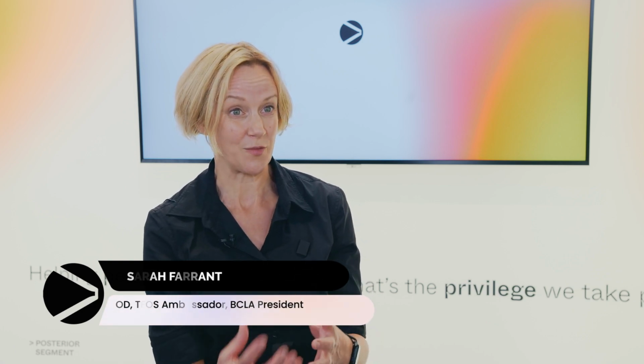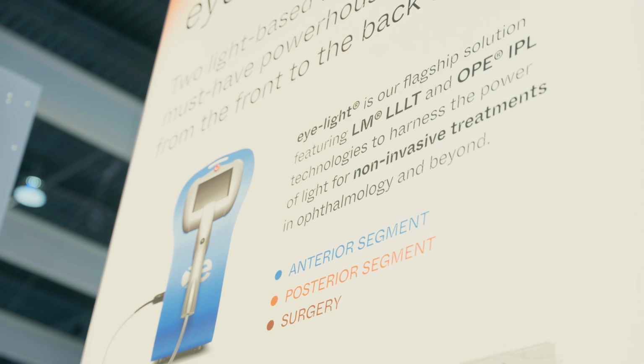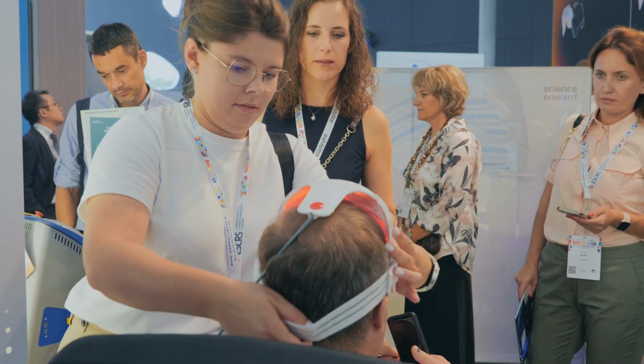Shortwave blue low-level light therapy has a unique set of strategies in which it works. So when we consider the role of dry eye disease and the clinical importance of the dysbiosis of the ocular microbiome, we can start to think about utilizing shortwave blue therapy to help control that dysbiosis. When we have lost that homeostatic balance because of dry eye disease or because of anterior segment issues, we can use shortwave blue to help regain that balance and reset the dysbiosis, to challenge the saponification and the bacterial load, to reduce the impact that the biofilm is having on the ocular surface and the consequential effect on inflammation.